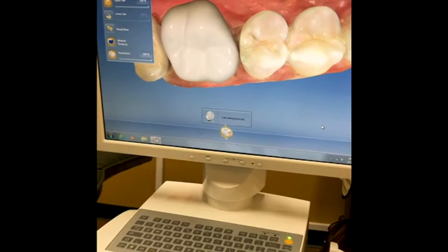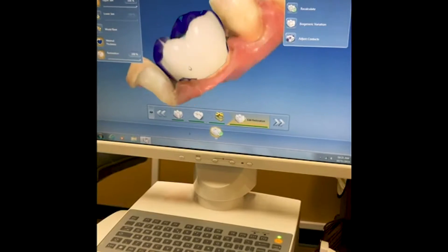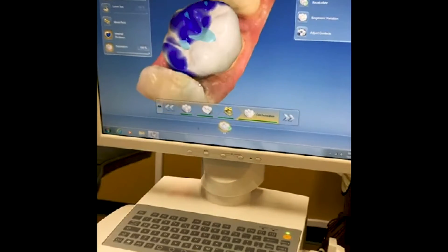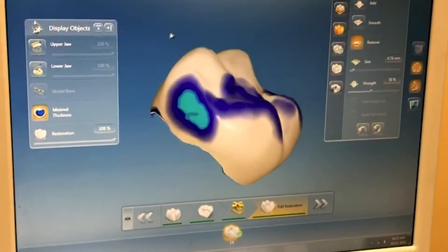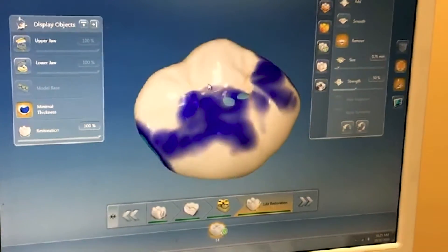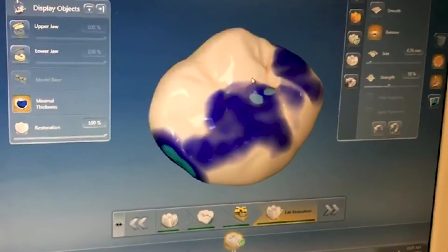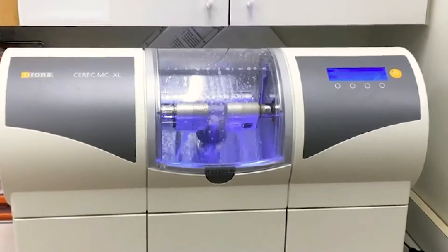Previously this would have been done by a laboratory technician in a lab and taken two or three weeks, but now we can complete the entire process in less than two hours usually. Here we've designed a crown and we can look at it in three dimensions, we can make any necessary adjustments, and make sure that it fits properly. Then we'll send it across the hall to a milling machine.